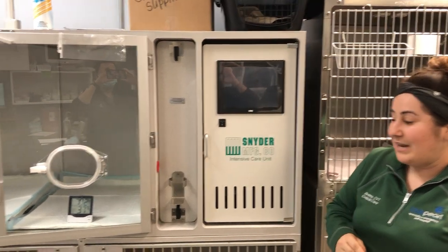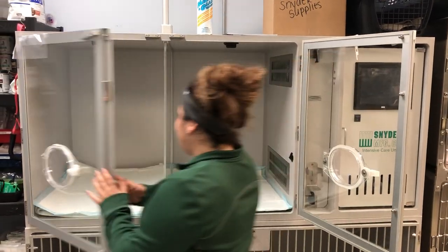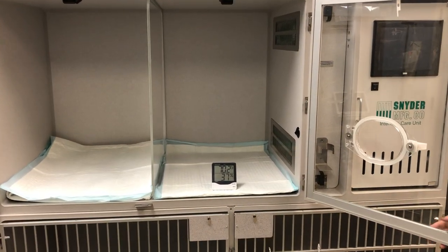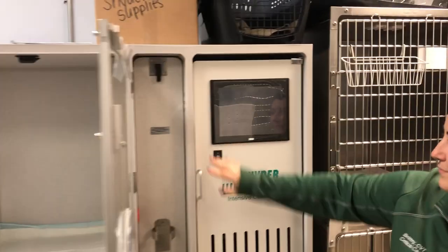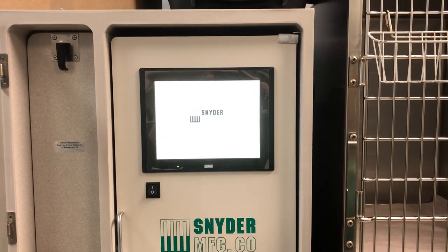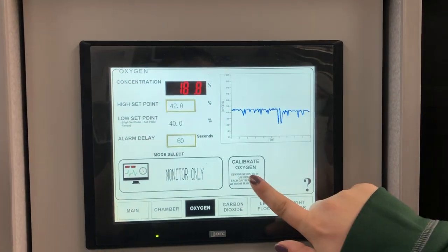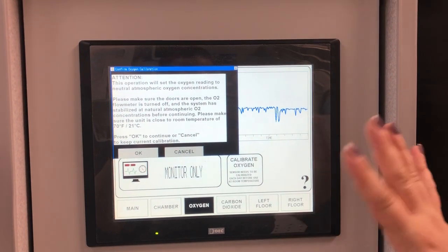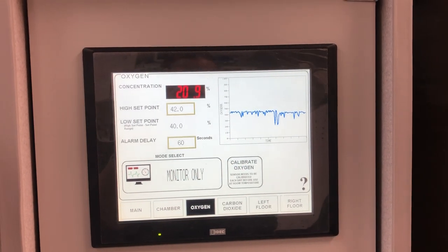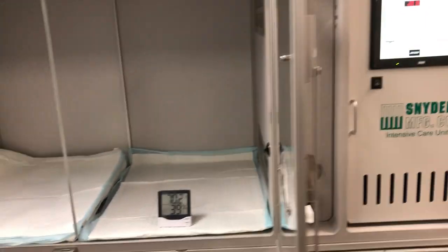The first step before any patient goes into it, it should be calibrated. You want the door to be open and the inside of the unit to be as close to 70 degrees as possible. Once it's at 70 degrees, turn on the unit, press here in the oxygen panel, and select calibrate oxygen. It will tell you it has to be close to 70 degrees — click OK. Now it's calibrated to 20.9% and the calibration is done. The doors have remained open the entire time.